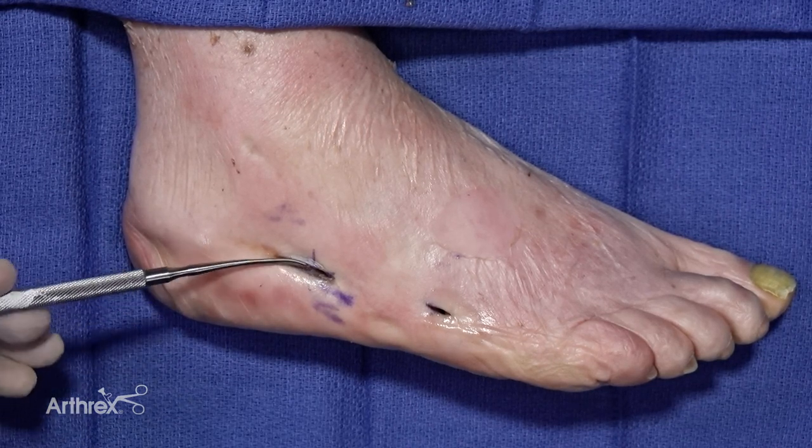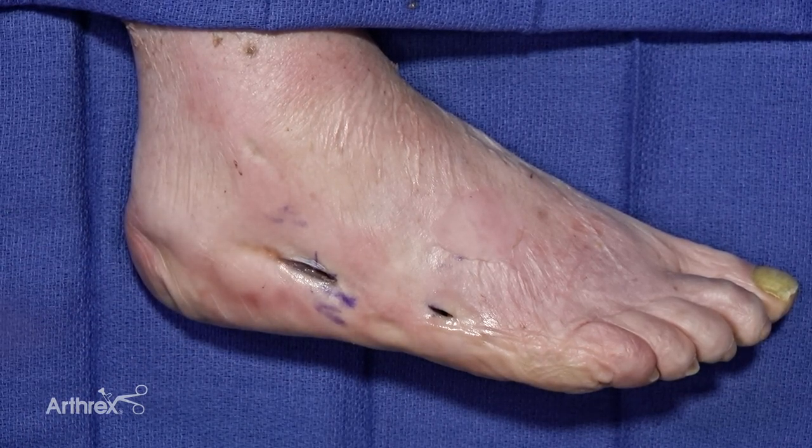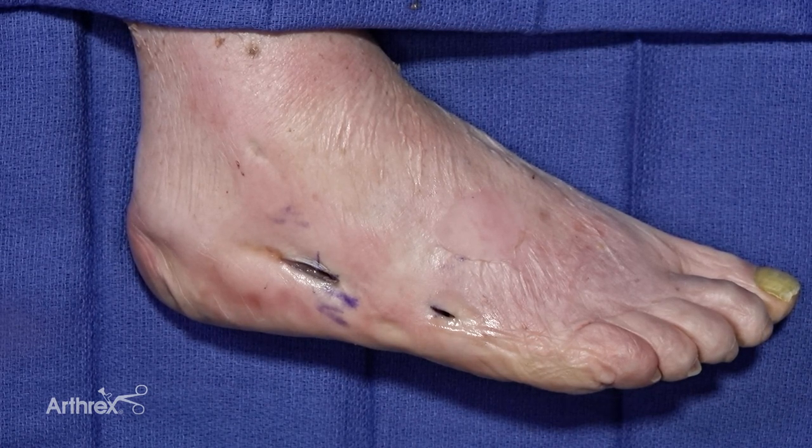In addition to that, we will also under fluoro go through the intramedullary space and then inject at the site of the fracture a small volume of the BioSurge product as well.